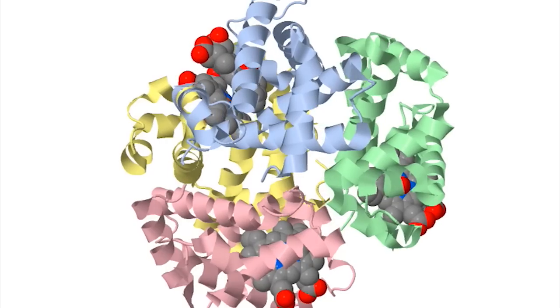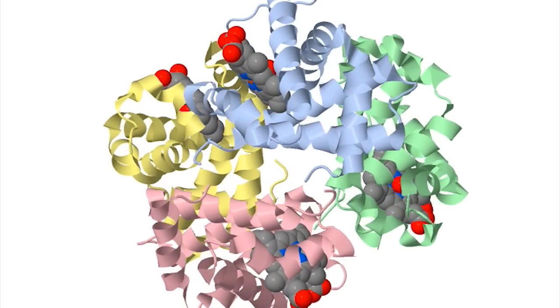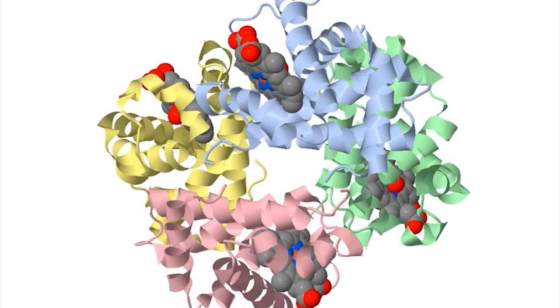It simply states that the amount of light absorbed is proportional to the concentration of that substance, the absorption coefficient of that substance, and the length of that substance that light needs to pass through for any given amount of that tissue. Now, the two substances that are of concern for pulse oximetry are oxygenated and deoxygenated hemoglobin. Each of these two substances has very different absorption coefficients, particularly at different wavelengths of light.